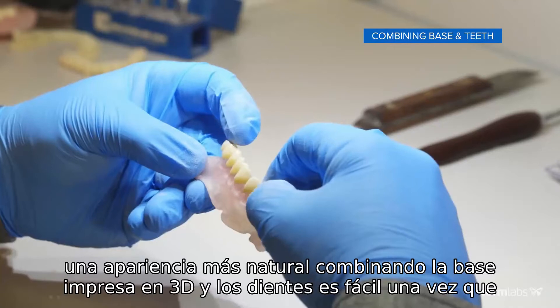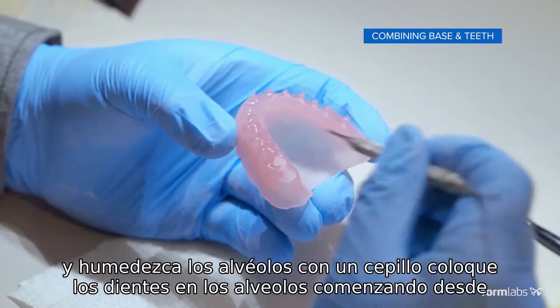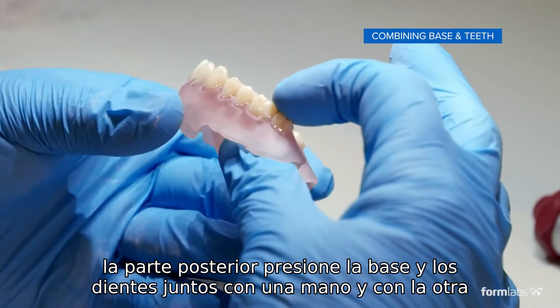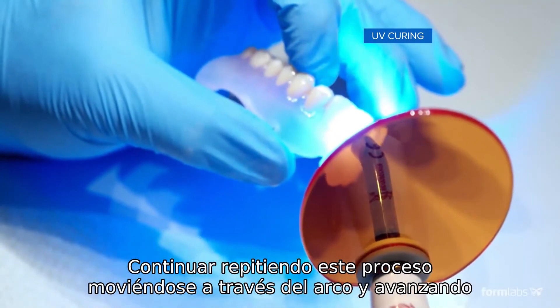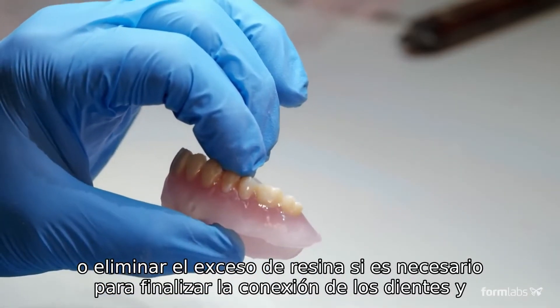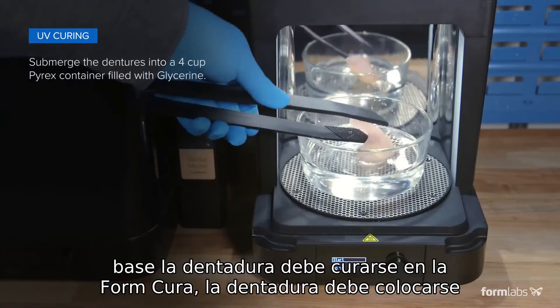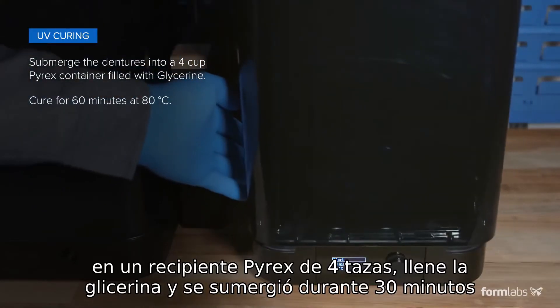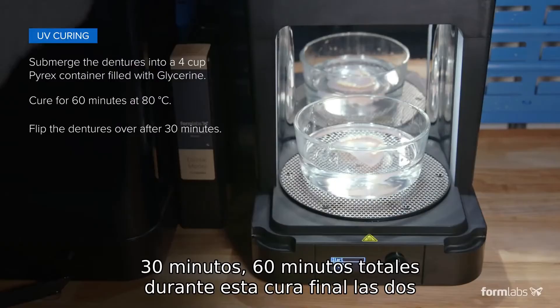Combining the 3D printed base and teeth is easy. Once you've removed the supports and washed your parts, take a small cup of denture base resin and wet the sockets with a brush. Place the teeth into the sockets starting from the posterior. Press the base and teeth together with one hand, and with the other hand use a handheld UV cure light to tack the parts together. Continue repeating this process and move across the arch and forward until complete. You can also add denture base resin to the interproximals or remove excess resin if needed. To finalize the connection of the teeth and base, the denture should be cured in a Form Cure. Place the denture into a 4-cup Pyrex container filled with glycerin and submerge it. Cure for 30 minutes, then flip it over for an additional 30 minutes, for 60 total minutes.